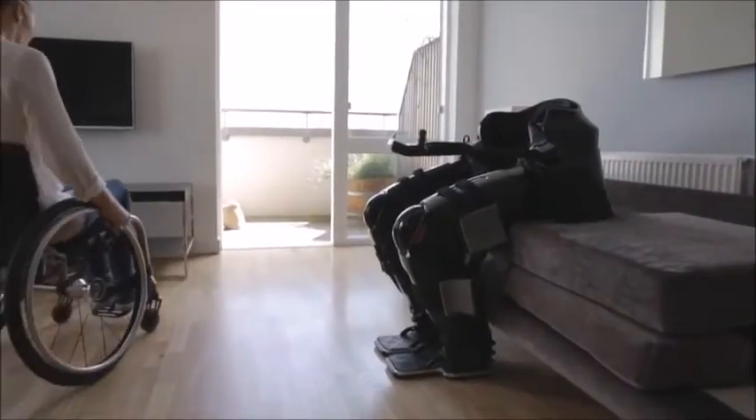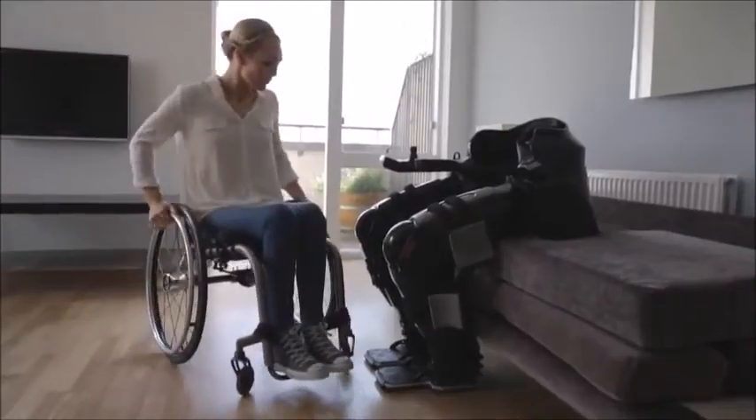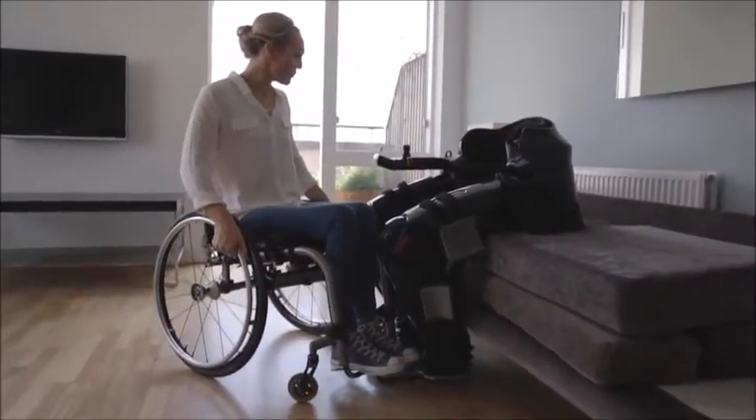I'm Sophie Morgan, an ambassador for Rex Bionics. I'm going to be explaining as well as demonstrating the many functions that Rex is capable of, as well as showing how easy it is to transport. Having been using Rex for over a month or so, I'm very confident transferring myself in and out unaided. I'm a level T4 complete following a car accident 10 years ago, but it's possible to use Rex with levels up to C4.